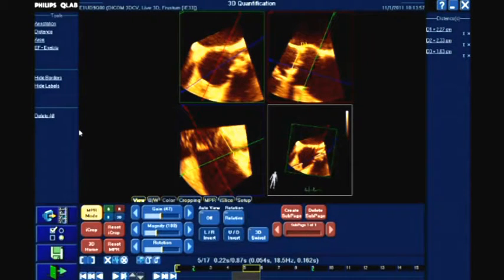And finally, if we wanted to, we could make some sinus measurements, and I'll just illustrate one of the sinus measurements here for you, but of course we could rotate around and make multiple measurements, and in this particular case we've got a sinus measurement of 29 millimeters. So three key measurements that we require in terms of assessing the suitability and the type of valve, the size of valve that we're going to use for this TAVI case.